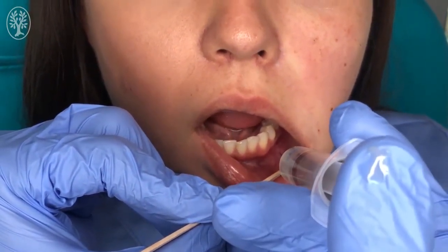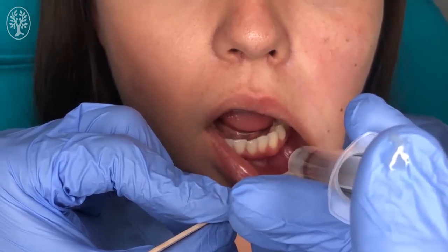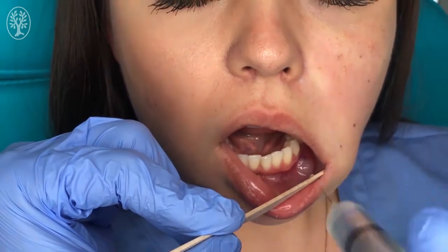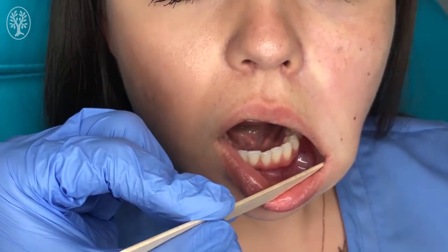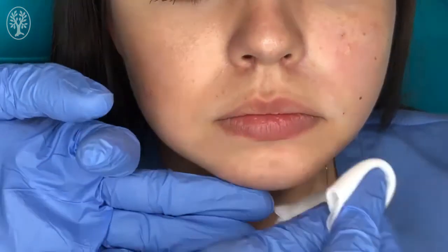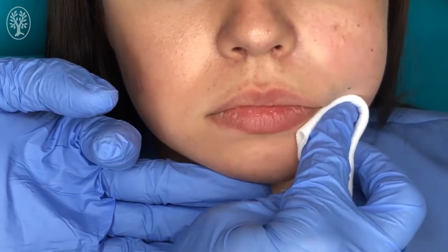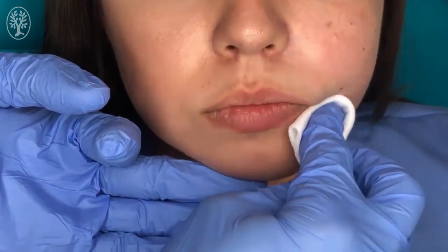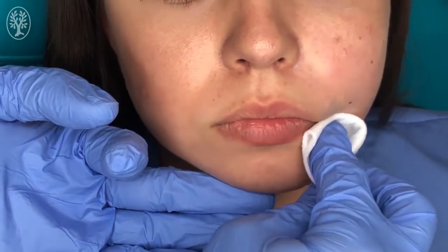We are going to go down and create a wheal of about one centimeter. That is going to cause the blockage of the mental nerve. Then after that, we are going to get a little gauze and do some gentle massage in the area so the anesthetic distributes, and in that way the mental nerve is going to be blocked.